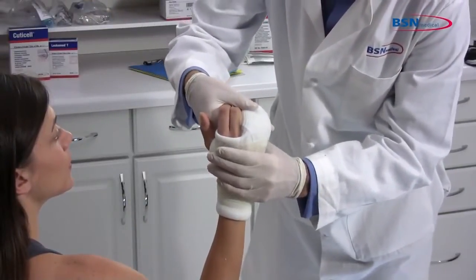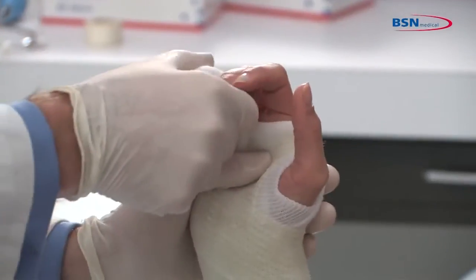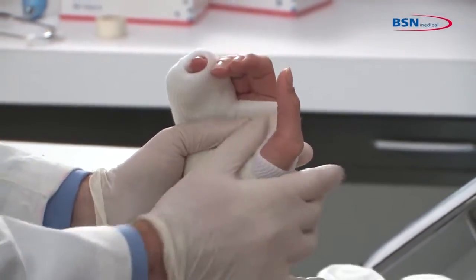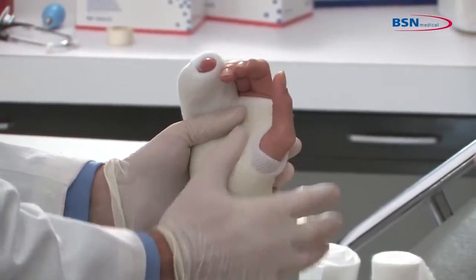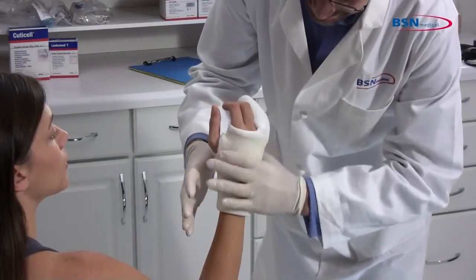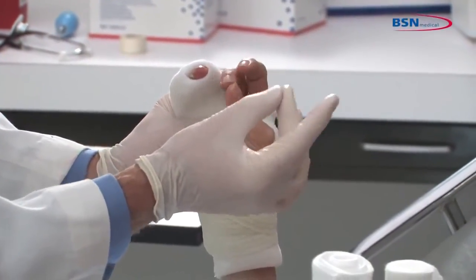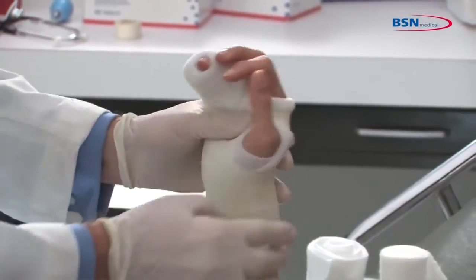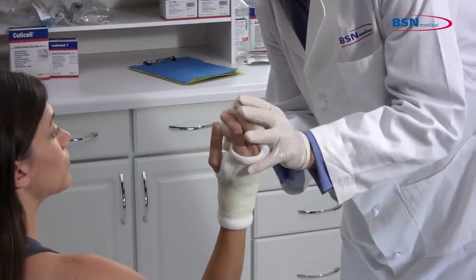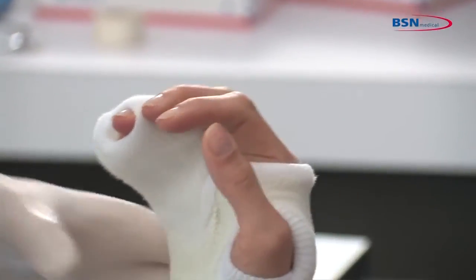Follow physician's instructions on the proper positioning of the limb. A common position for a boxer's fracture is with the metacarpal phalangeal joint flexed to 90 degrees and the proximal and distal interphalangeal joints at full extension. The wrist may be put into slight dorsal flexion. Once completed, check for any limitations in range of motion, any pressure points that may cause irritation, and you are finished.